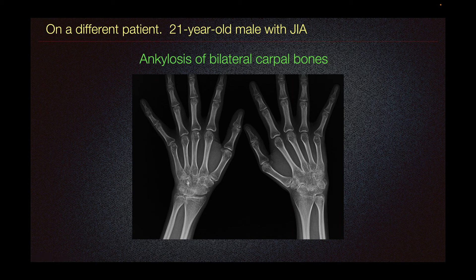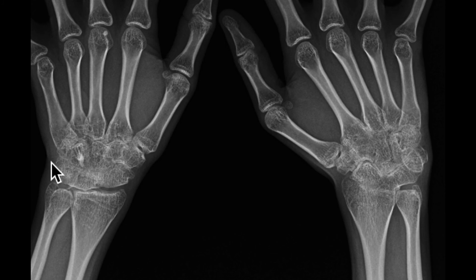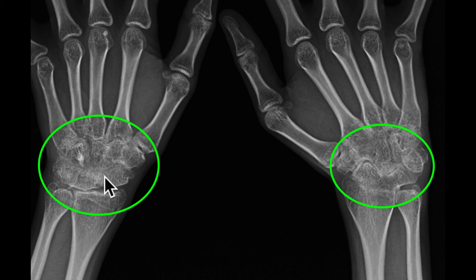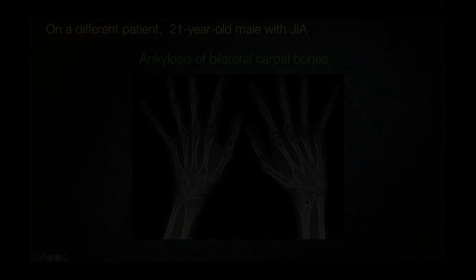This is a different patient, a 21-year-old male with JIA. Here we can see ankylosis of the bilateral carpal bones — fused carpal bones bilaterally without any detectable joint space in this region. There may be slight joint space visualized in some areas, but most of the carpal bones and the radiocarpal articulation are fused.